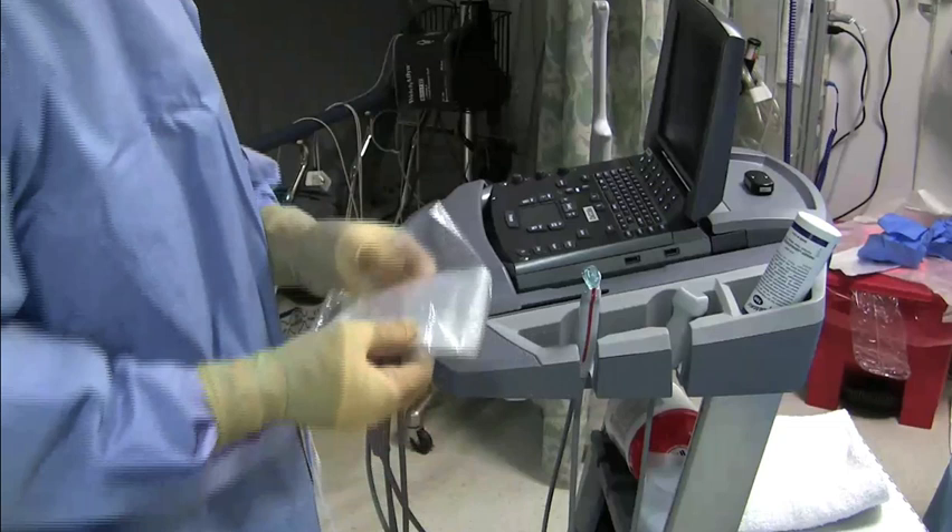Welcome. This is a short instructional video on how to place a sterile transducer sheath over a probe for an ultrasound-guided procedure.